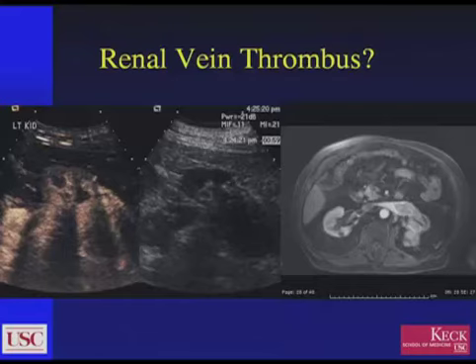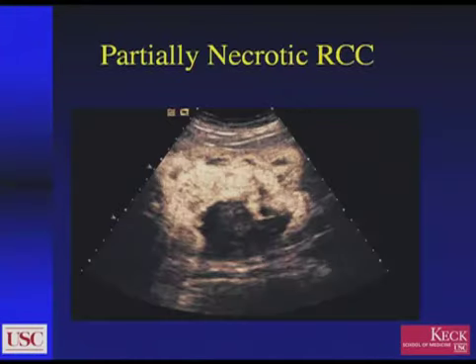One of the areas that you can also look at is the finding of renal vein thrombosis. We found that this tends to be somewhat challenging on contrast. Potentially we don't have enough experience with this yet, but you can see that there are some defects within this area of the renal vein corresponding to this large thrombus seen here on the contrast enhanced MR.